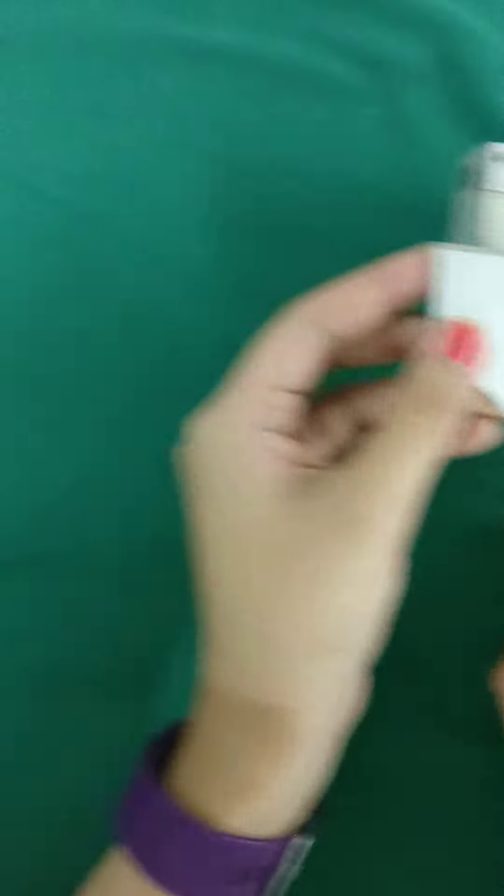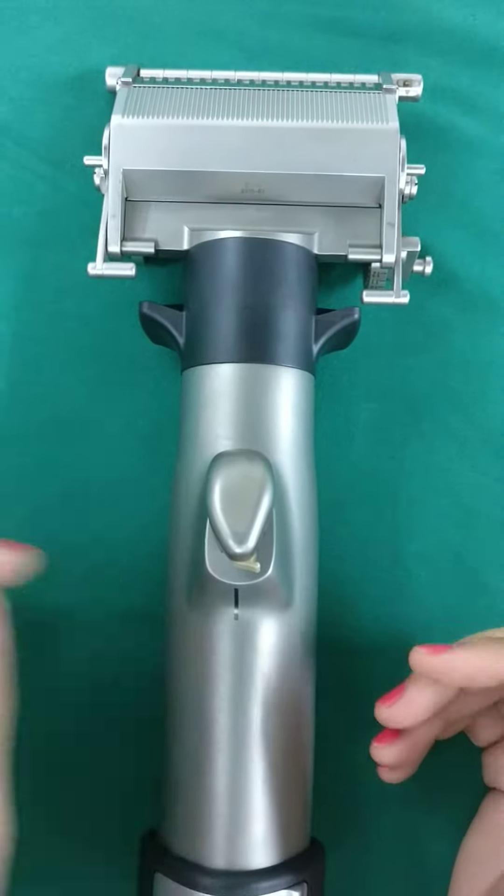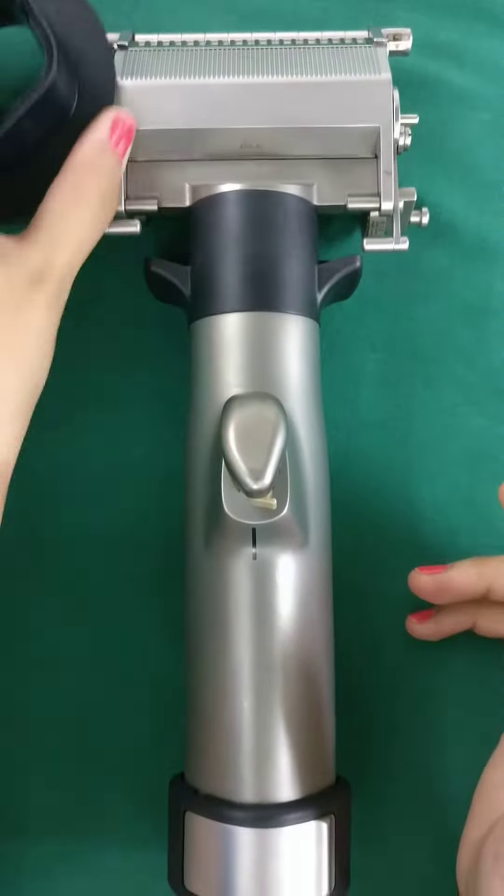It used to take a lot of time. Now we have shifted over to state-of-the-art battery-powered dermatomes. You can have those with electrical outputs or the complete manual battery-powered ones.